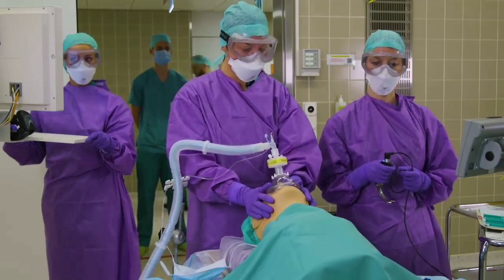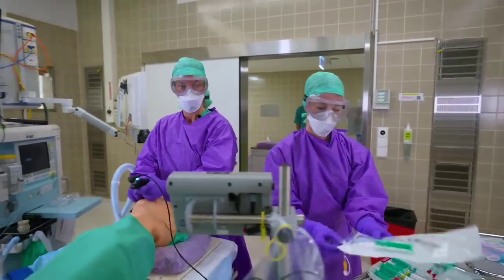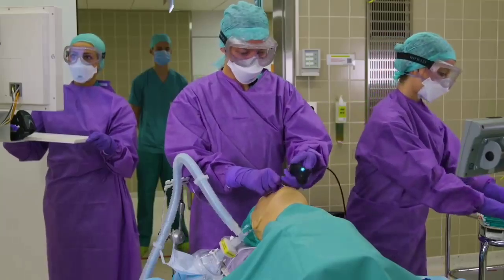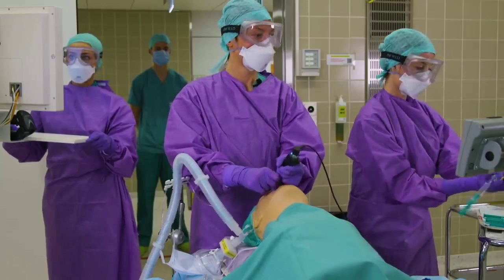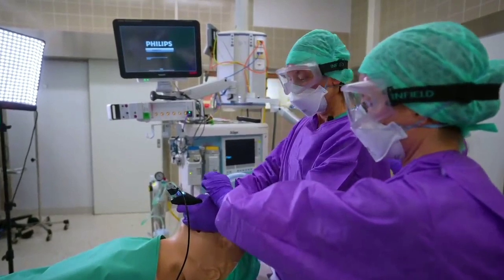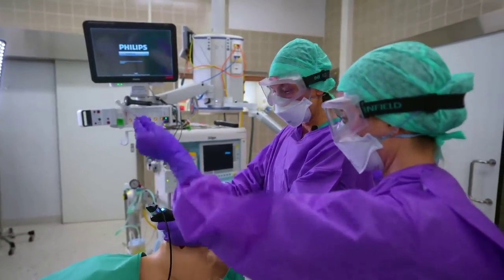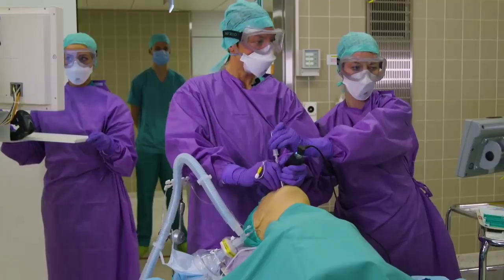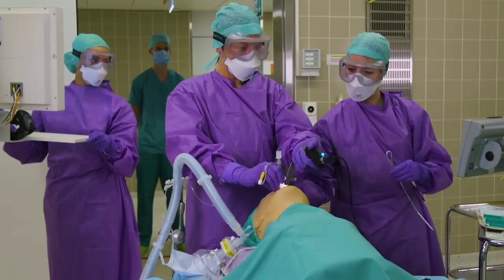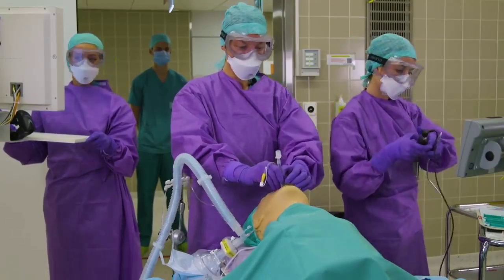We are now intubating the patient with a video laryngoscope, utilizing an endotracheal tube with a stylet in place. The endotracheal tube is now in place and the stylet can go. It's important to inflate the cuff before ventilating the patient.